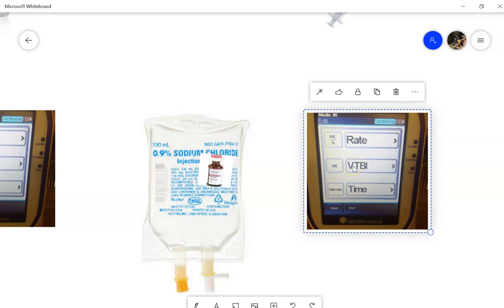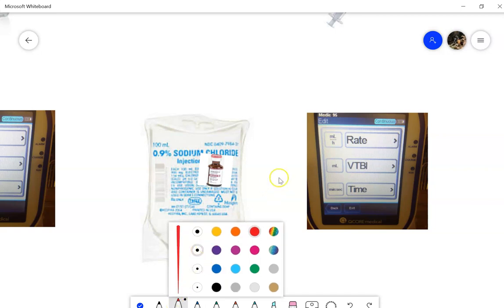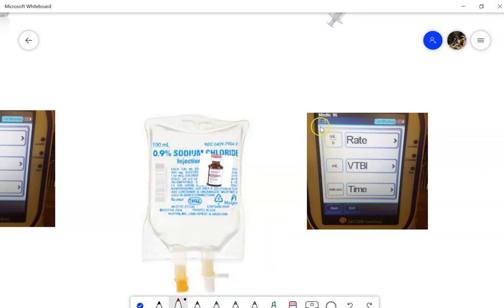So we got into general mode. And remember, we always have to pick 2 out of the 3 things here. We have 2 out of 3 options. One of them must go, and we're going to enter the other 2 in. So let's look at this and say, well, do we know the rate? If we know we want to give this 150 of amiodarone, which we put into 100 mLs, and we want to give that over 10 minutes, do we have any idea how many milliliters per hour that is? If you figured that out in your head that fast, then go for it. But most of us are thinking, no, we don't know what that is. So we're going to cross that out. We're going to say, I don't know how many mLs per hour I want to give here.